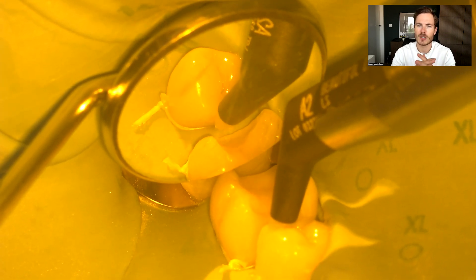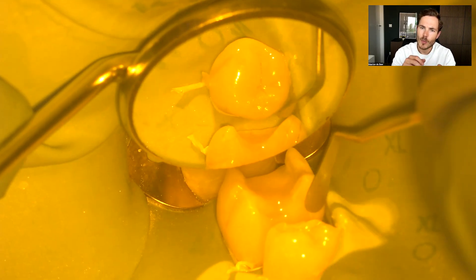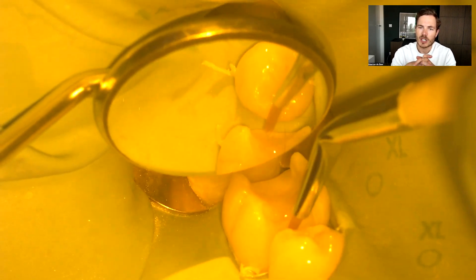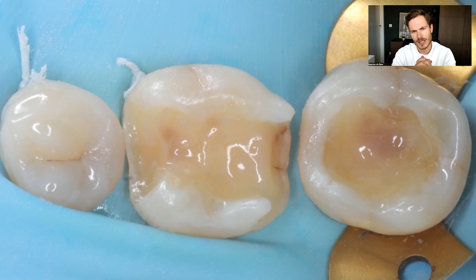The distal side of this tooth is quite flat, so I use a little bit of Shofu Beautifil 2 LS in color A2 to reshape the distal side of the second premolar, making it a little more round following a more natural anatomy. I use my instruments to make it as smooth as possible and always finish with a brush — in this case a brush by GC. You can bend them slightly; this one is bent at a 45-degree angle, making it a lot easier to reach the distal side of the second premolar.